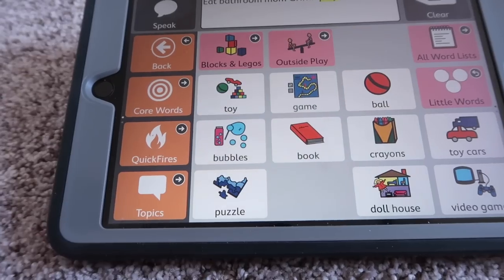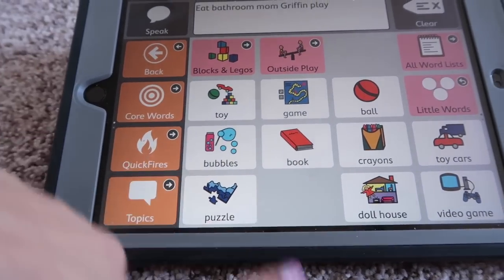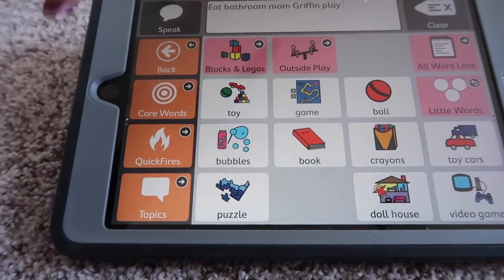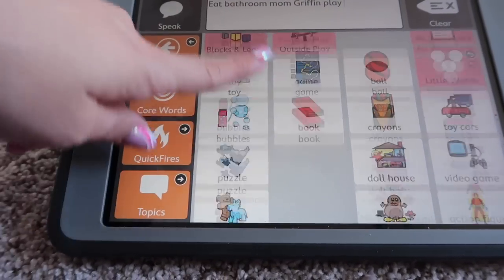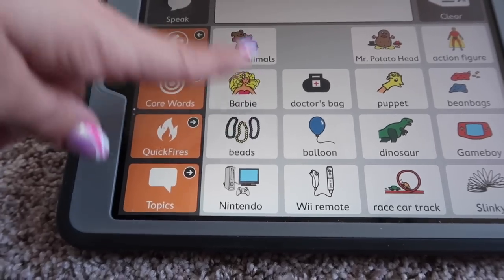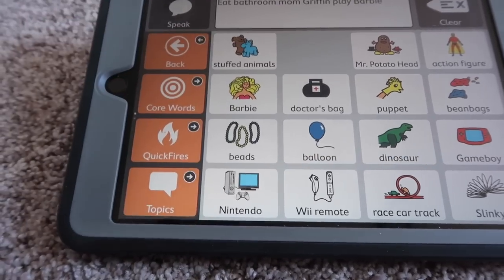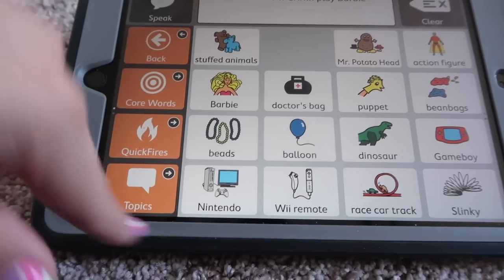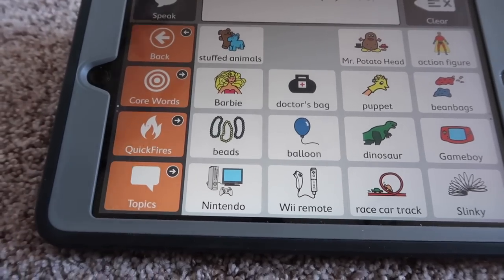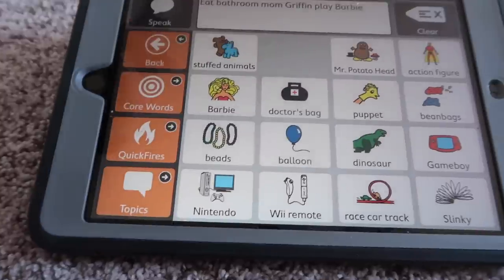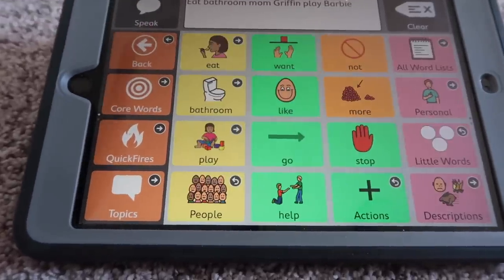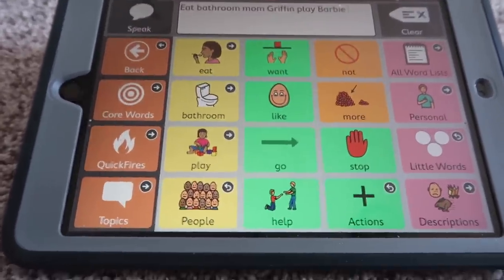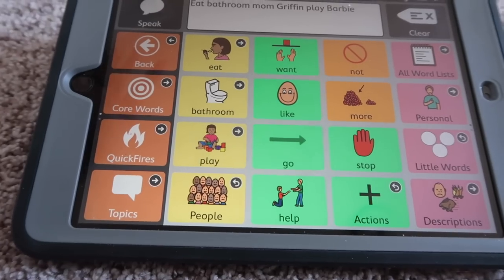We have play and we have like dollhouse, bubbles, crayons, things she's been doing. It scrolls — there's even more. We have Barbies. I'm still in the beginning of editing. I might take out like Nintendo since she doesn't play with that yet, and we don't have a Mr. Potato Head, so I might take that one out too. But our therapist doesn't really want us to take out much at all because she's so capable.